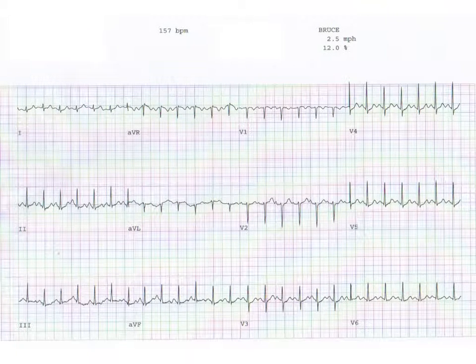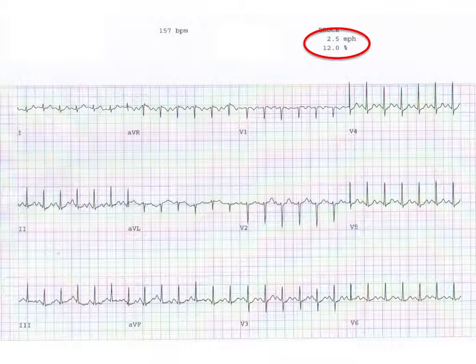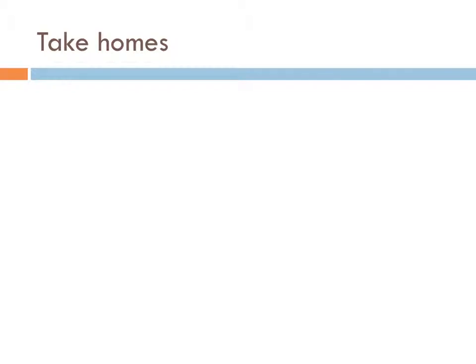So I'll just finish up by showing this EKG. This is a decent quality EKG, pretty readable, but I just want to point out that this was done while someone was walking on a treadmill at 2.5 miles an hour up a 12% incline during a cardiac stress test. So you can very reasonably get an EKG not only while someone is walking on a treadmill using the things that I've outlined here, but you can certainly get it on a patient that's laying down supine in a moving ambulance.